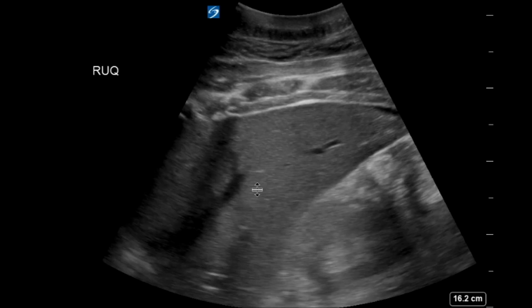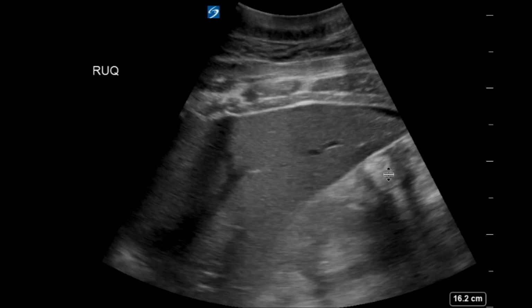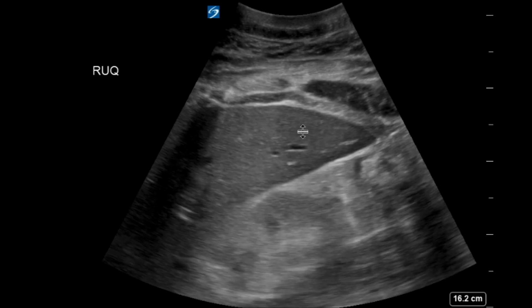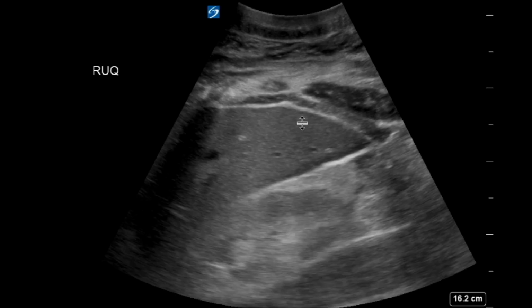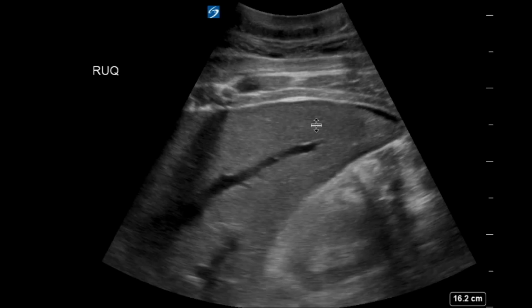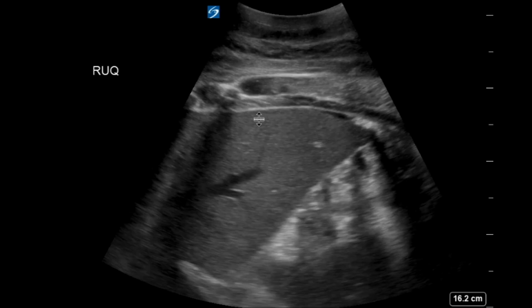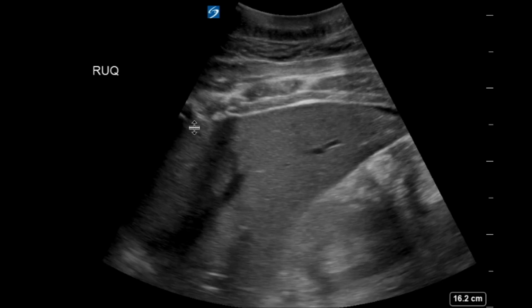As we look towards the top right of the liver, the apex of the liver, we see some fluid, like a small fluid collection there. I guess that could be any number of things: blood, bile, ascites. Yeah, and urine potentially. There's no history of trauma in this patient, but with the abdominal distension they were considering ascites. So let's take some more looks here.